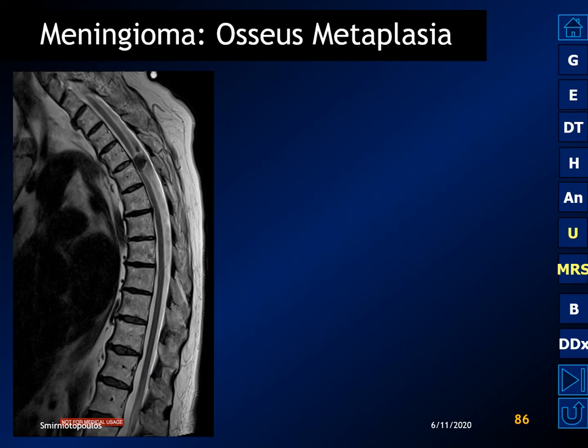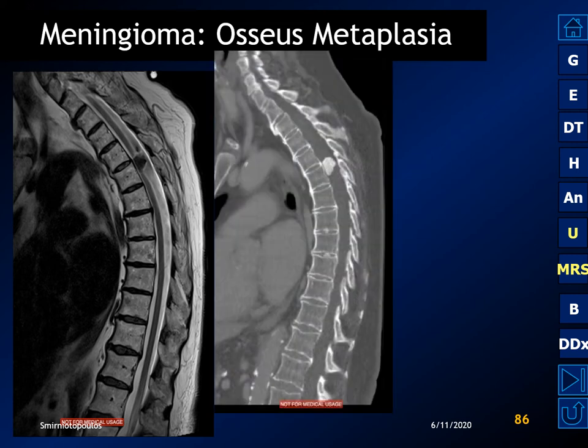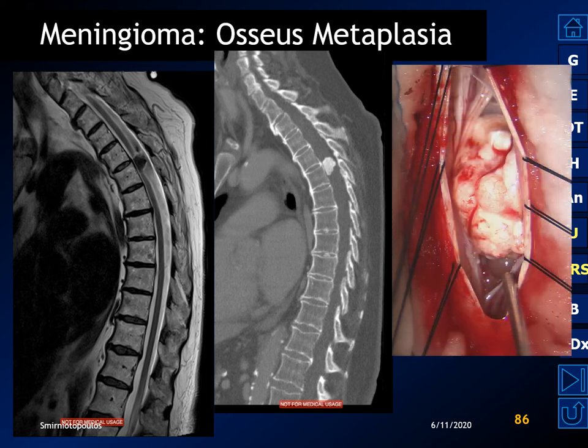Here is a patient with a spinal cord meningioma. We can see dramatic hypointensity on the sagittal T2-weighted MR and remarkable hyperattenuation on CT reformation. This is not due to psammomatous calcification but rather to osseous metaplasia with the formation of a mineralizing osteoid matrix.